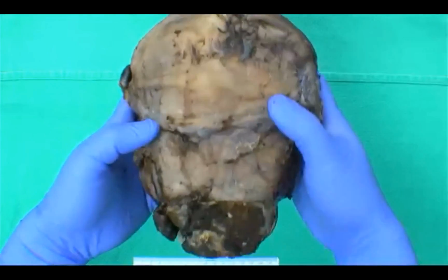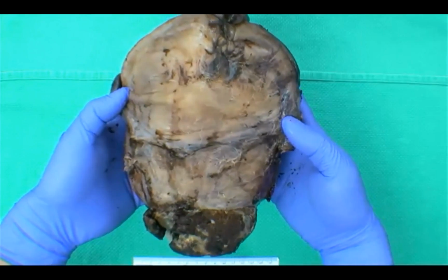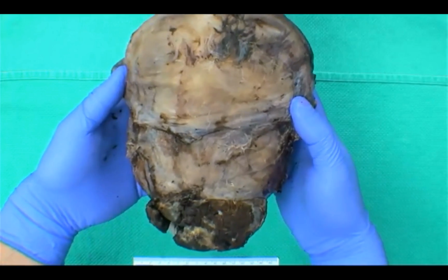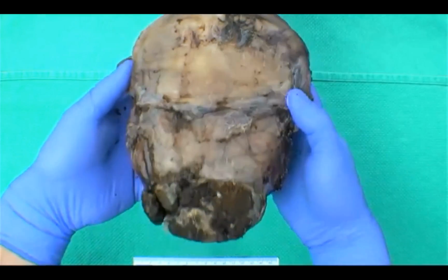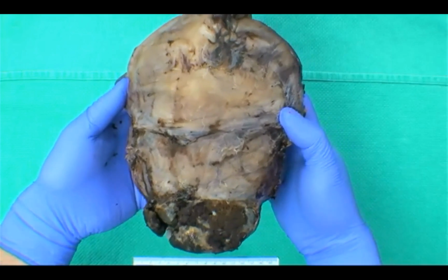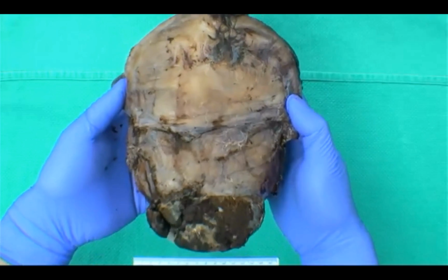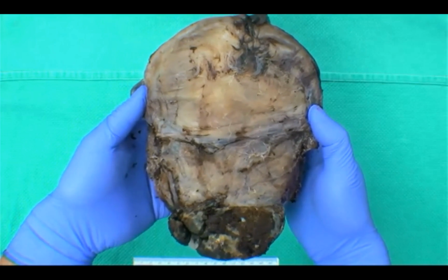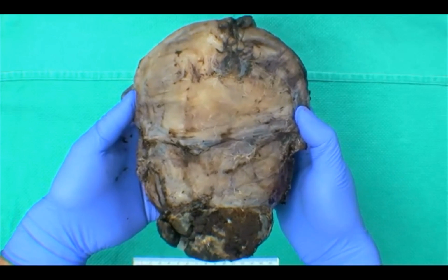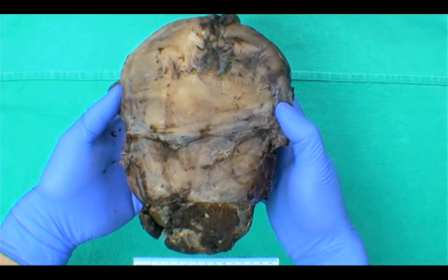The next obvious question is to ask everyone the reason why this uterus was taken out. Given that it's a gravid uterus, or postpartum, can anybody in the chat tell me what are some reasons why a hysterectomy would be performed immediately after pregnancy? Okay, leiomyomas, not so much. Postpartum hysterectomies at this level are usually medical emergencies, or fairly critical procedures. They do it fairly soon after the baby is delivered.